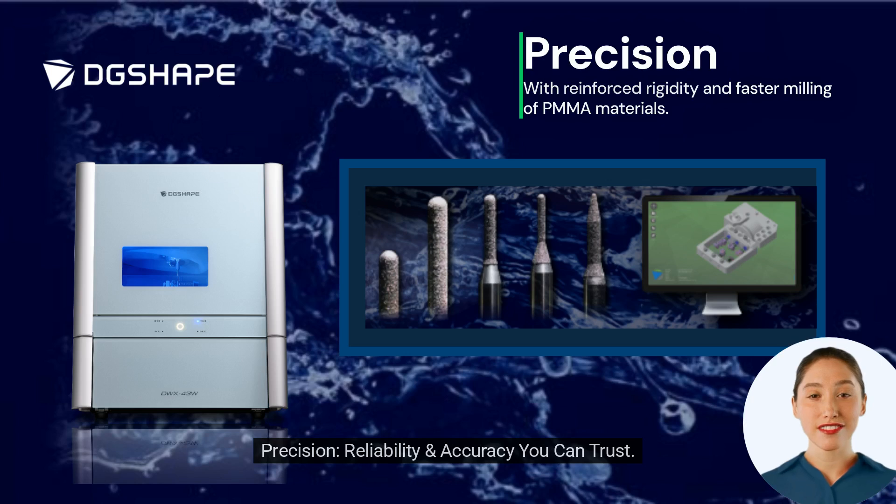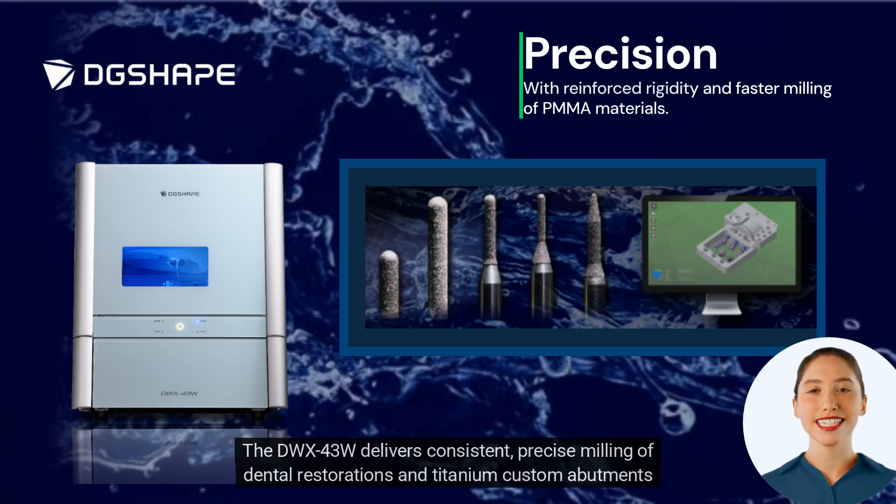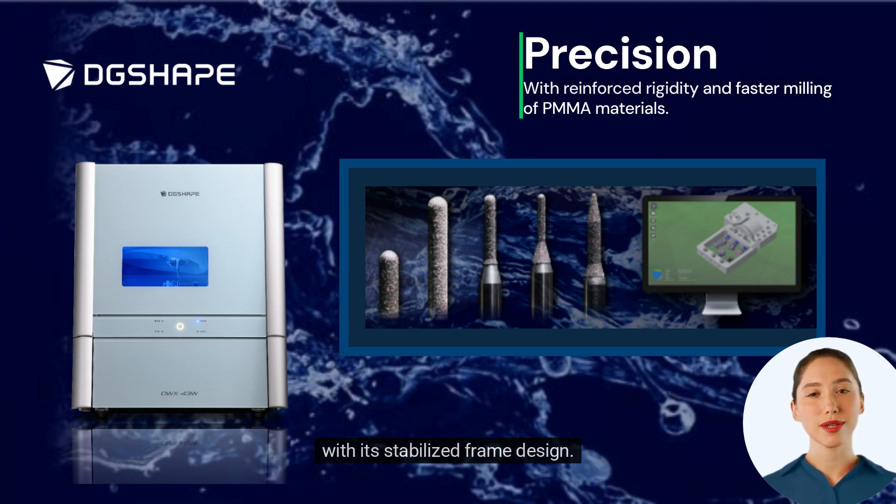Precision, reliability, and accuracy you can trust. The DWX43W delivers consistent, precise milling of dental restorations and titanium custom abutments with its stabilized frame design.